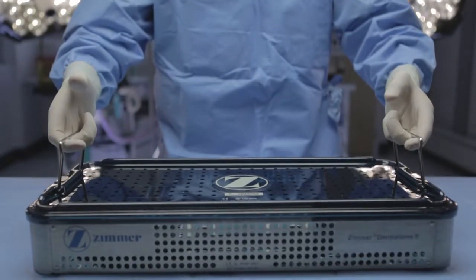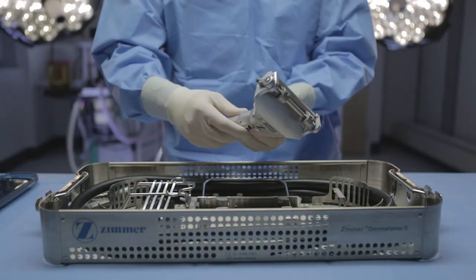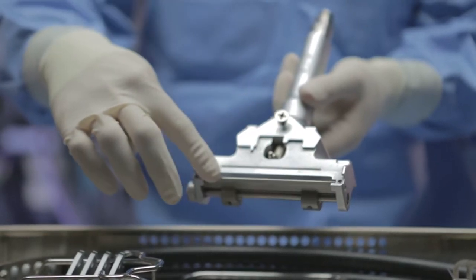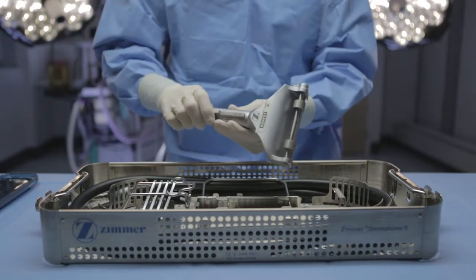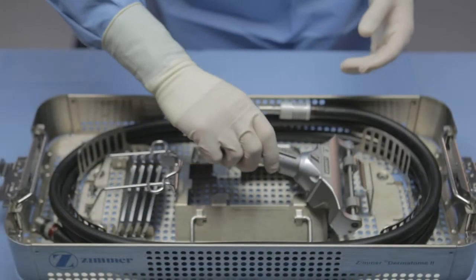Carefully inspect all the components, especially before each use. Pay particular attention to the underside of the Dermatome where the blade oscillates. There should not be any burrs, nicks, gouges or scratches. If noticeable damage does exist, return the instrument to Zimmer for repair.